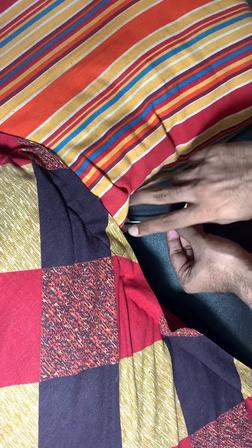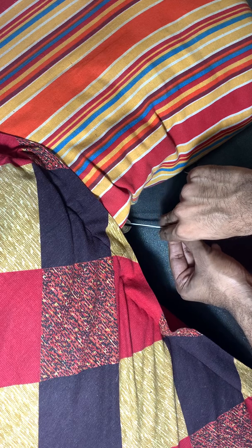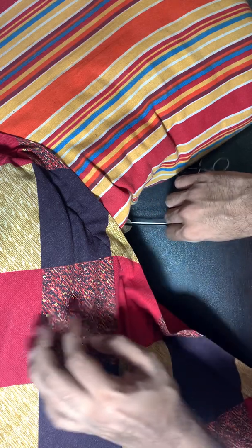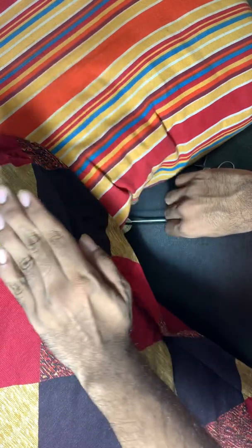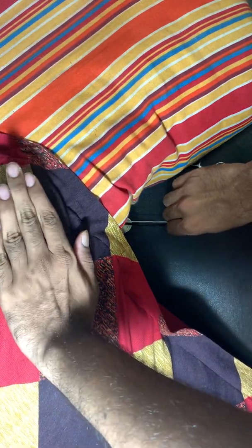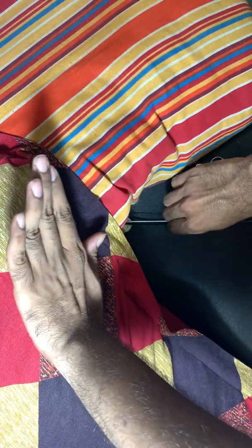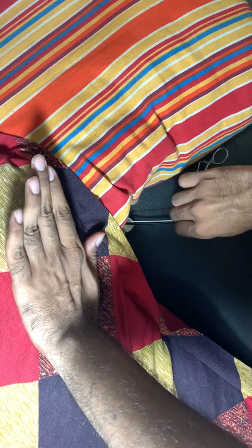Then, hold the cord along the clamp. Provide sustained downward traction. My left hand is placed over the symphysis pubis, with the palmar surface facing towards the umbilicus, to provide counter traction.